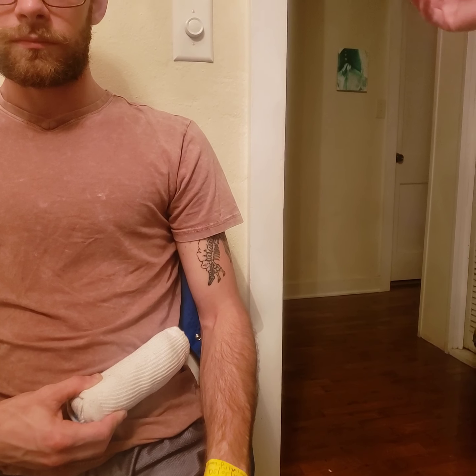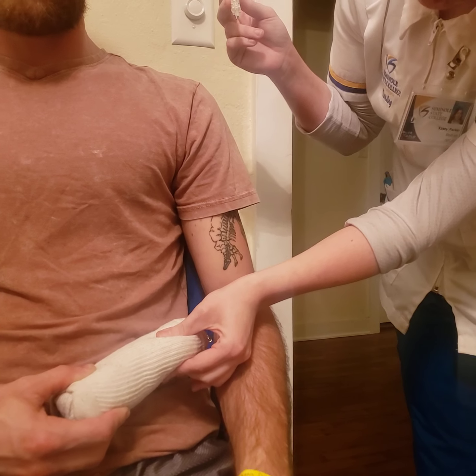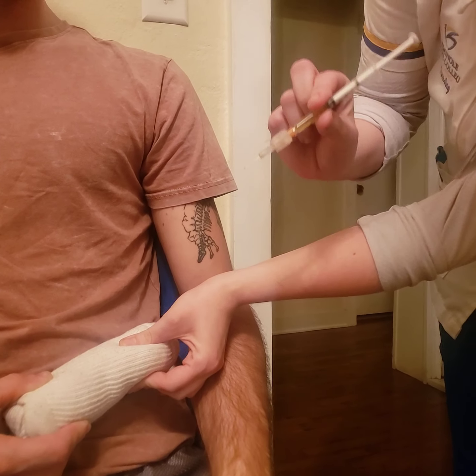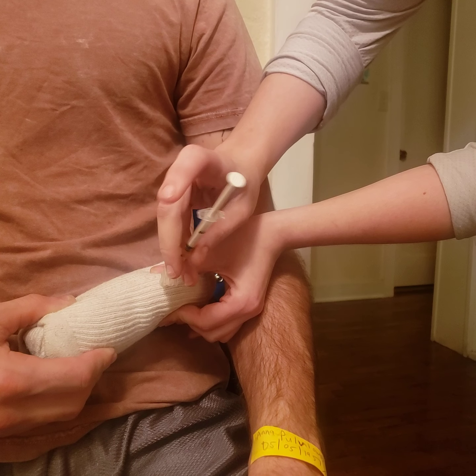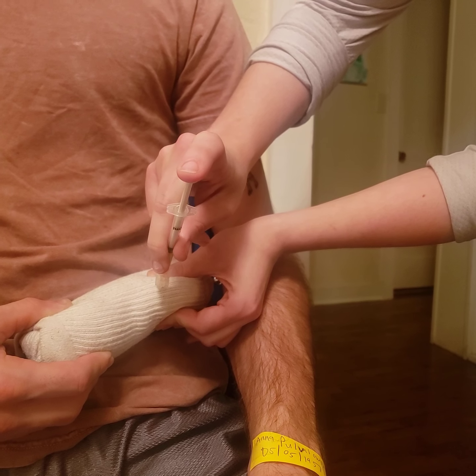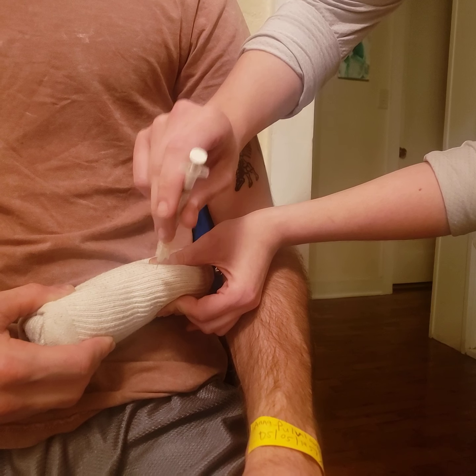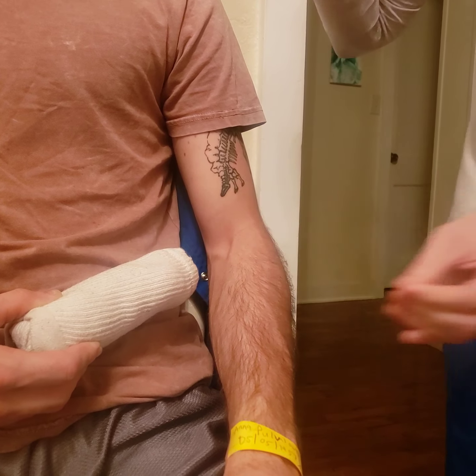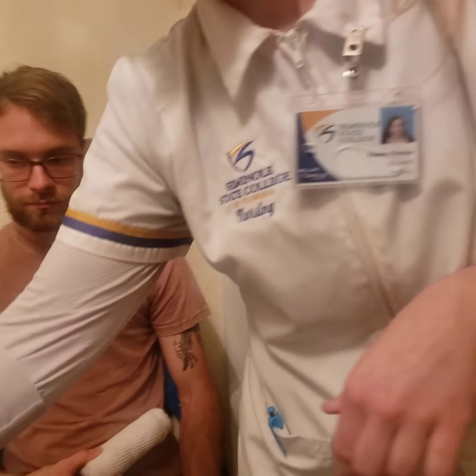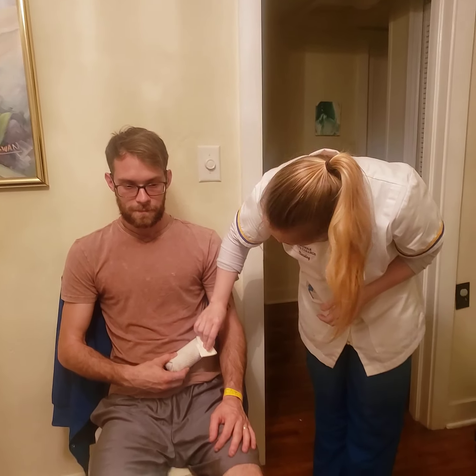Okay, Miss Pawlowski. I'm gonna pinch the subcutaneous fat up for about 1 inch. And I'm going to be darting it in at a 90-degree angle, just as before. Okay. We're going to slowly inject that one. Okay, and I can withdraw my needle at the same angle, and then I can release. I'm going to engage the safety for my needle, and this will go into the sharps biohazard. And the same thing, we're going to flatten this, shouldn't be too much.